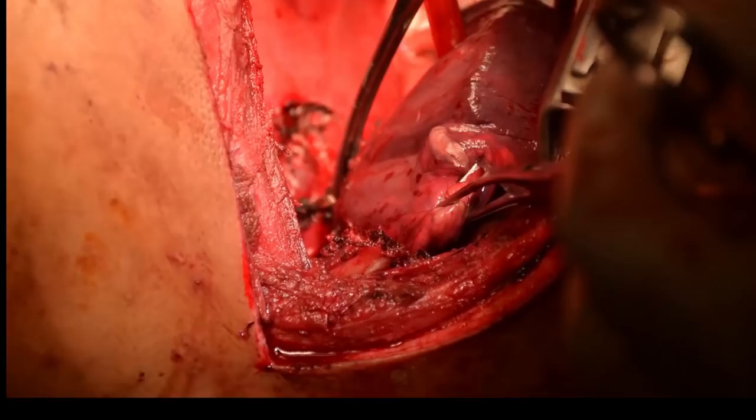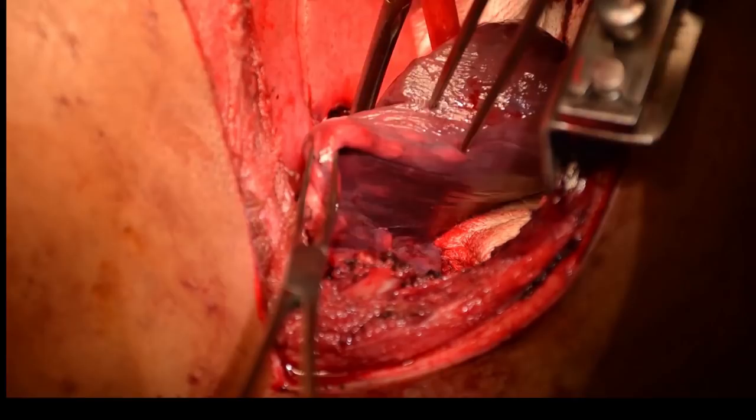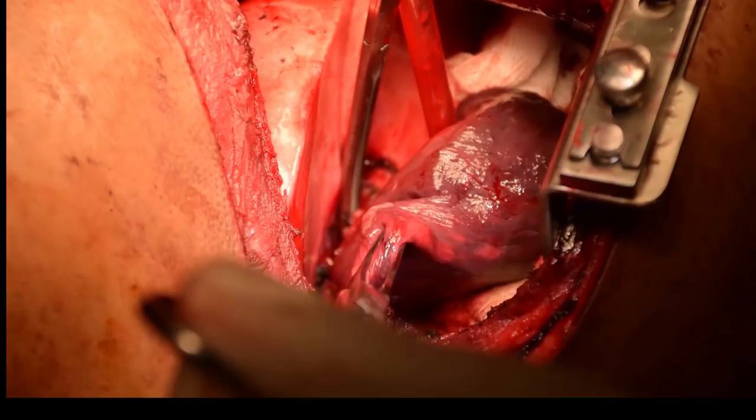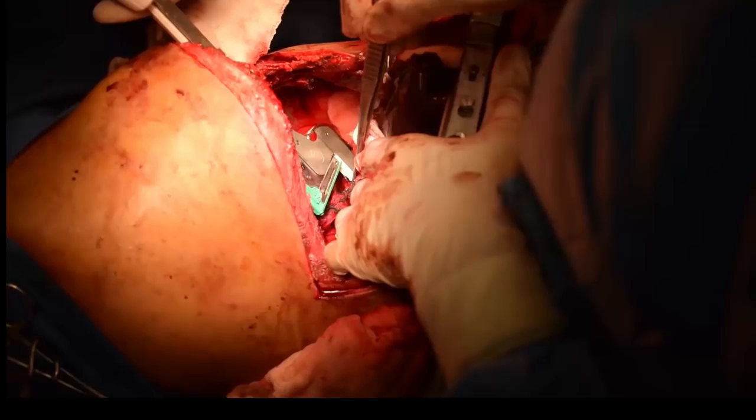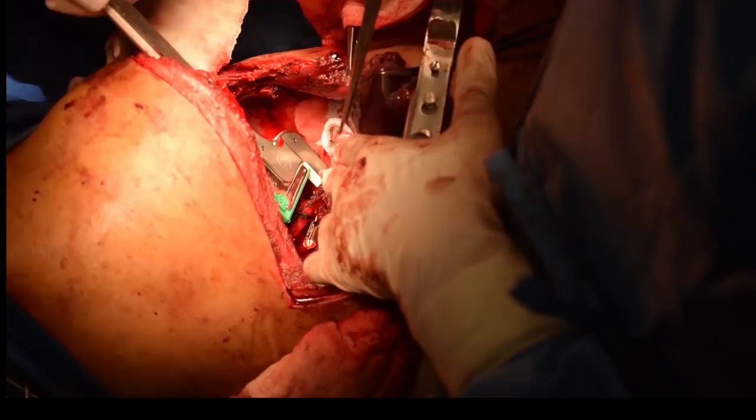We then came to the bronchus. We isolated the bronchus to the lower lobe, clamped it with a soft clamp, and inflated the lung to confirm that no other part — the middle lobe or any other portion — was being clamped. Once we were sure of the bronchus to the lower lobe, we stapled and divided it.